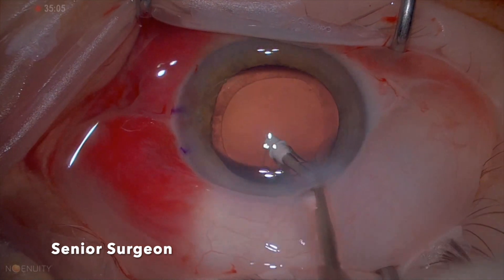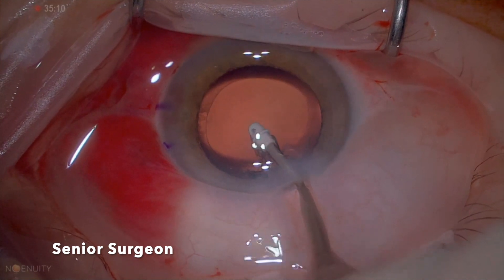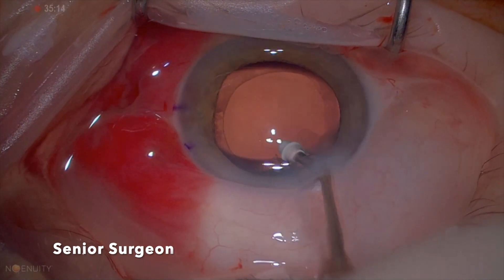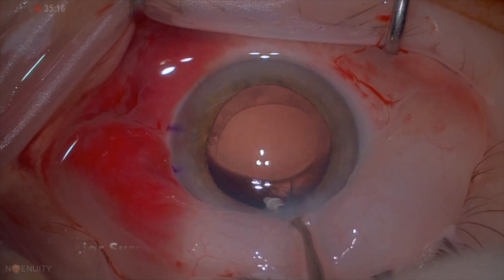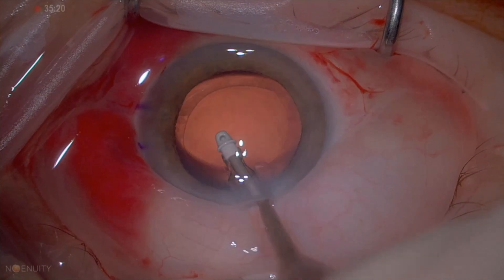This is a very safe position to remove the cortex. And again here, trying to tuck under the anterior capsule to get the cortex out. Working on the sides of the 12 o'clock position gives better access than working directly on the 12 o'clock position.